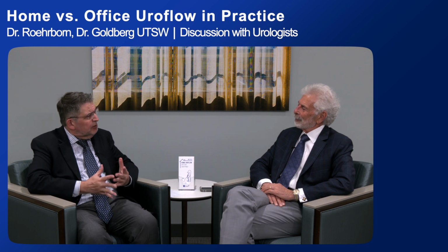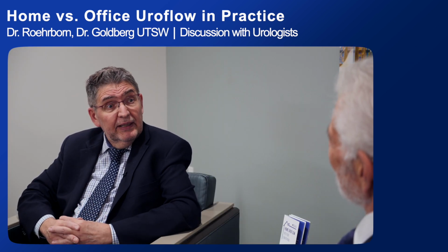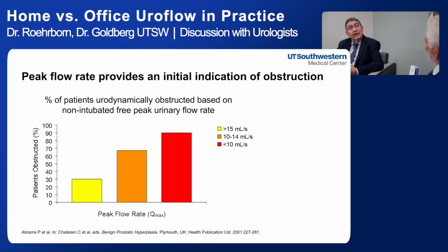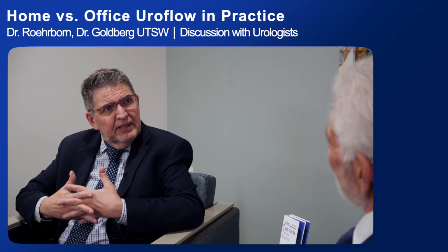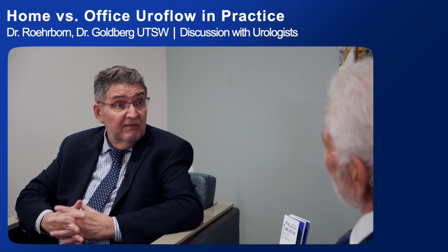So despite those problems, that number that comes out of it, the maximum flow rate, is a big to-do, because we learned from Paul Abrams that if a man has a peak flow of over 15 milliliters per second, he is unlikely to be obstructed. Under 10 milliliters per second, much more likely to be obstructed. And the guidelines say, if the patient is obstructed, you should consider surgical intervention, unobstruction. So this brings up this problem of the reproducibility and relying on a single value, doesn't it?